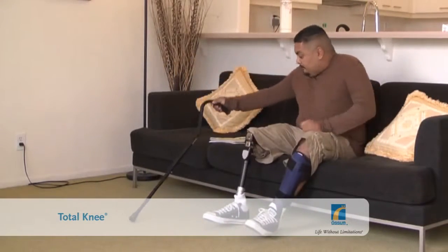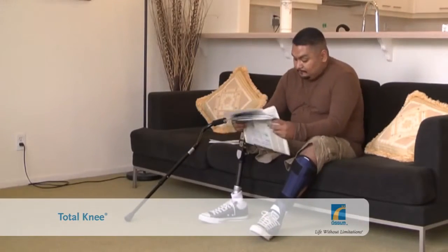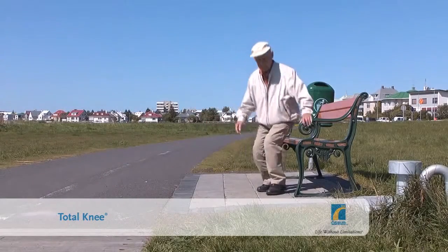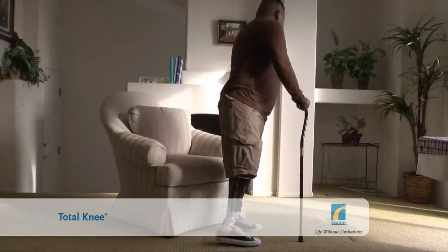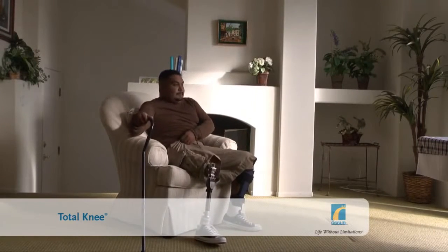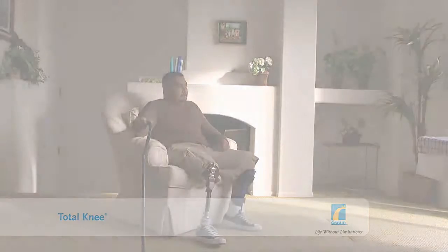It is important to remember that the knee will not provide any support or resistance as you sit, since the geometric lock is not activated while the knee is bent, so use your sound leg to control how fast you sit down. You may find it easier to use a chair with armrests, particularly if you are a new or bilateral amputee.